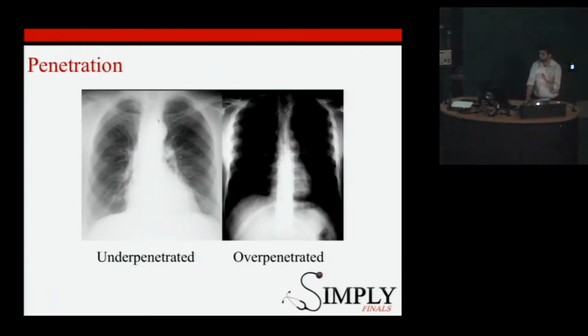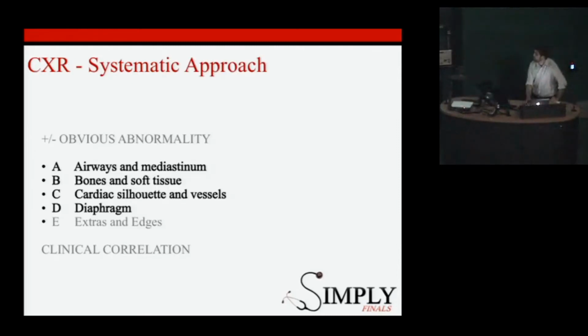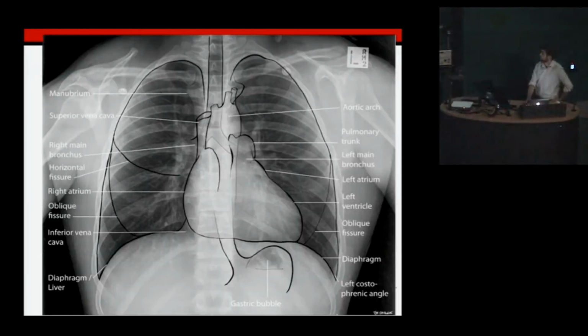So that's RIP. You just need to do it quickly. It'll take you 1 minute, and then when you're presenting, you don't need to go into depth about it unless they ask. Most likely they're going to give you good quality images, unless they bring it up in an OSCE and you're presenting, because it's more detailed. So we'll go on to the actual X-ray now.